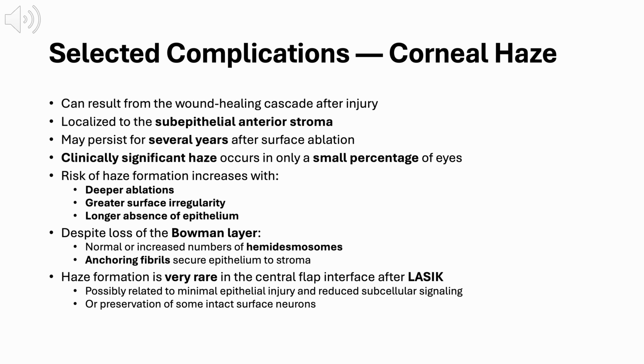In contrast, haze is very rare after LASIK, particularly within the central flap interface. This is likely related to minimal epithelial disruption, reduced keratocyte activation, and possibly the preservation of some intact corneal nerves, which dampens the wound healing signal. Clinically, this slide reinforces a central theme of refractive surgery. Optical outcomes are inseparable from biological behavior, and controlling wound healing is just as important as controlling laser ablation.